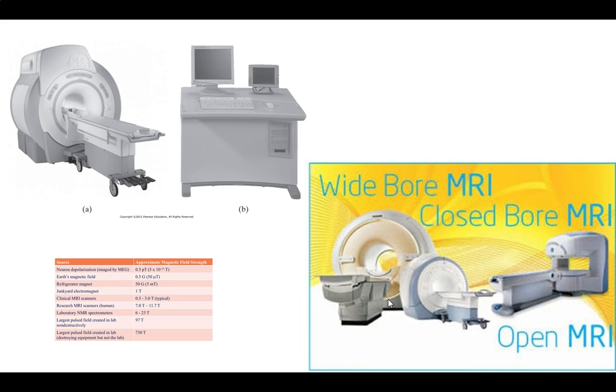Then there's what's called the open MRI. It's kind of taking the whole thing and twisting it 90 degrees, so you're coming into a slice in between the two. It's for people who are freaked out; it's much more open, because it's like two pillars with donuts top and bottom, so to speak. It's not going to be as good, I'll be honest. You'll still get a good image, but not as good as on a regular machine. But for some people, particularly with a longer acquisition time, it's a more survivable situation, I guess.